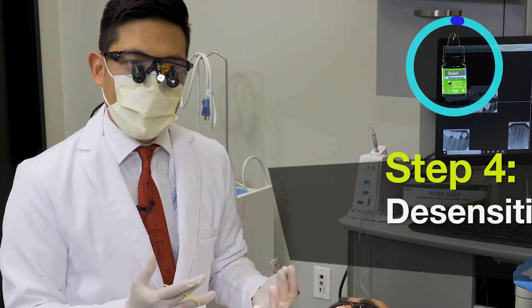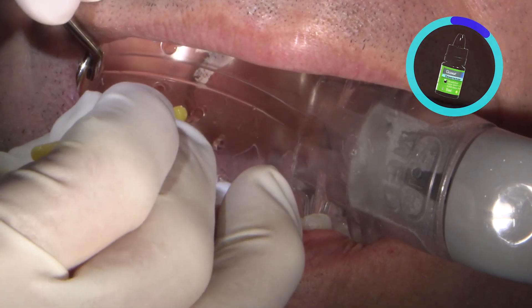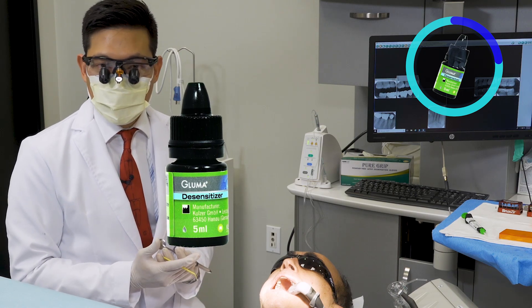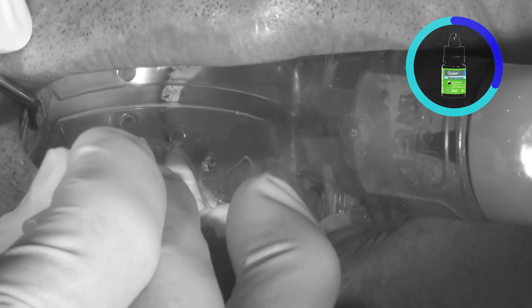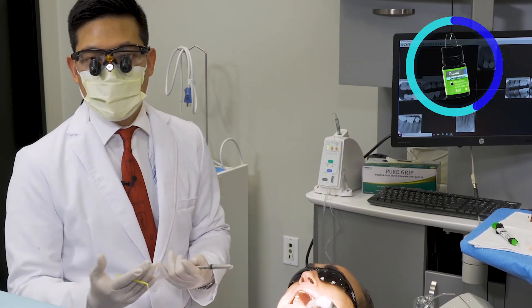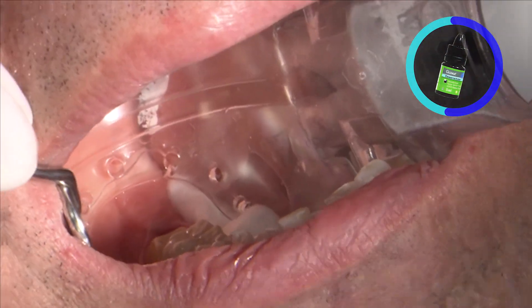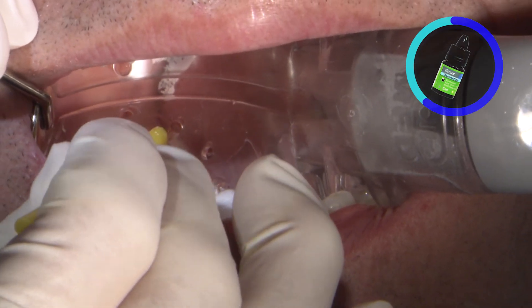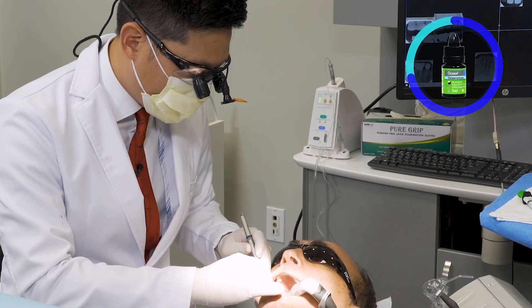A nice way to combat post-operative sensitivity — which has been proven to reduce the risk — is to apply a desensitizing agent on the preparation. In this case I use Gluma. Gluma is a glutaraldehyde and HEMA solution. The combination of that has been shown to greatly reduce the risk of post-op sensitivity. It also has a nice antimicrobial action to help clean the preparation. I lightly scrub that into the preparation to help the prep absorb the solution, and let it sit for about one to two minutes.